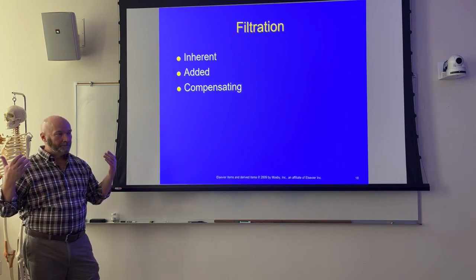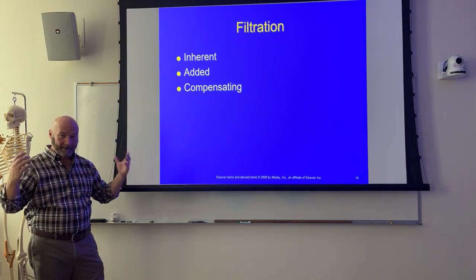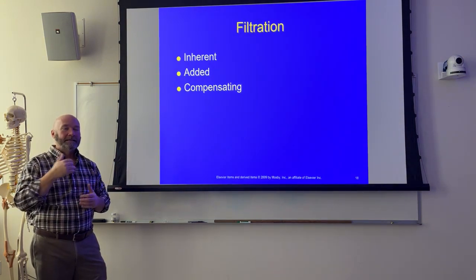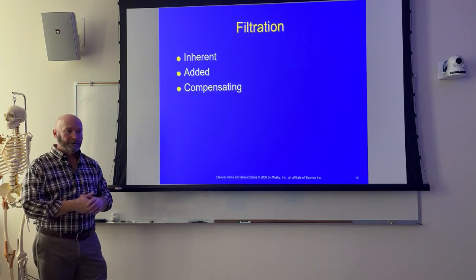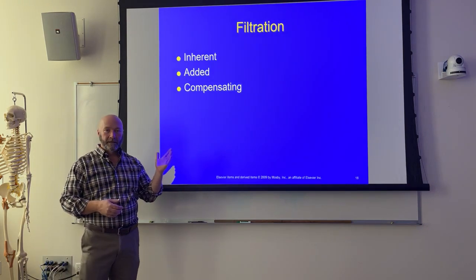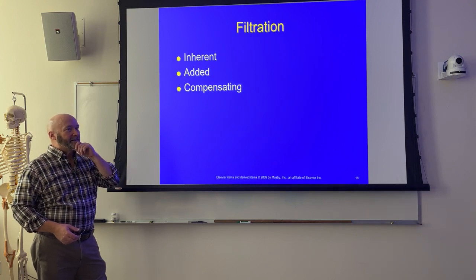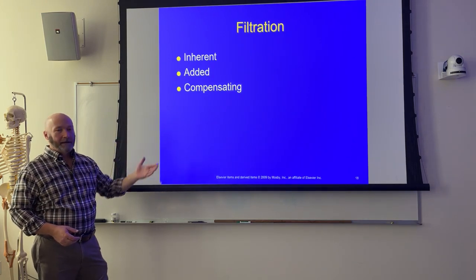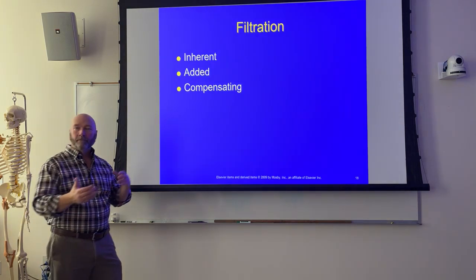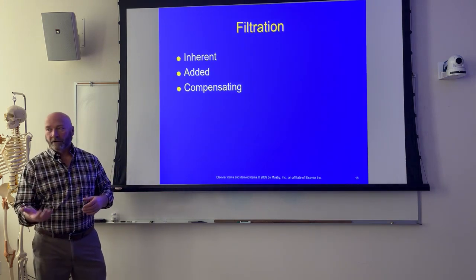Remember that we have to have that penetration through the patient in order to make an x-ray image. And any photon that just absorbs inside of the patient never has any chance of getting through the patient. For that purpose, it is useless, right? So we put filtration in to get rid of those low energy photons. So I could see where in a pediatric hospital they may increase the amount of filtration that they use to get rid of more of the photons that just aren't going to make it through the patient.